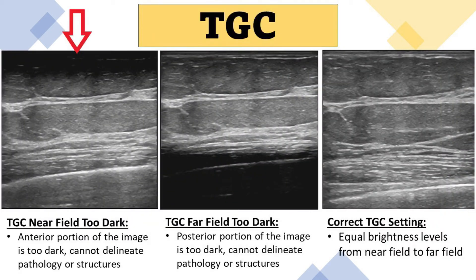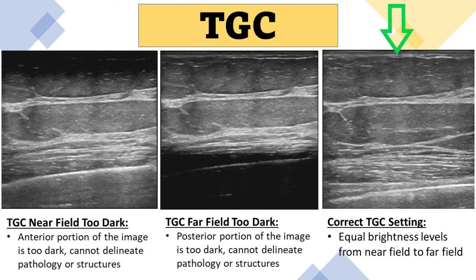In the first image, the TGC in the near field is set too dark, meaning the anterior portion of the image is too dark and you cannot make out the structures of the breast or visualize pathology. In the next image, the TGC in the far field is set too dark, making the posterior portion of the image too dark in color so you cannot make out structures and would easily miss pathology. In the last image, the correct TGC settings are applied, giving equal brightness levels from the near field to the far field.